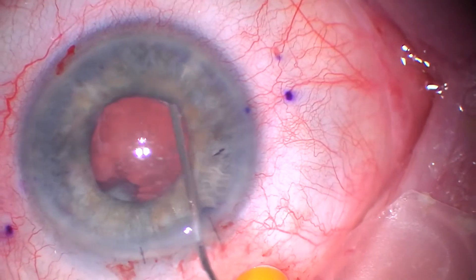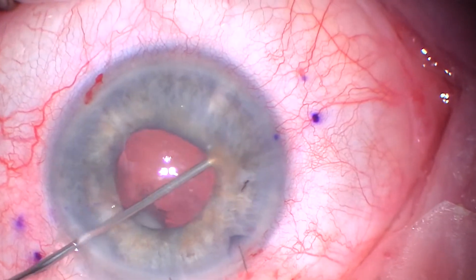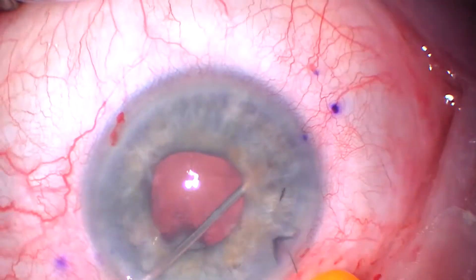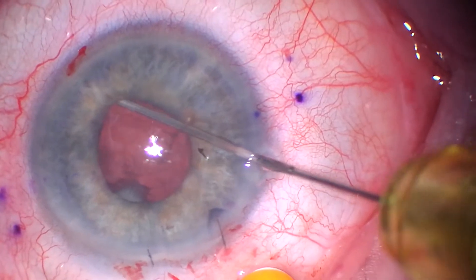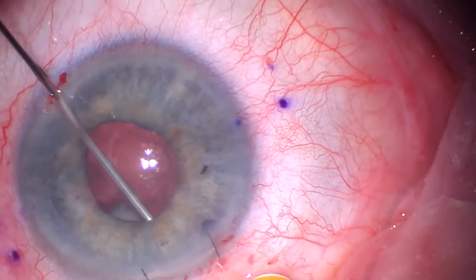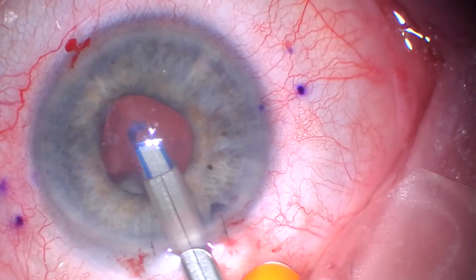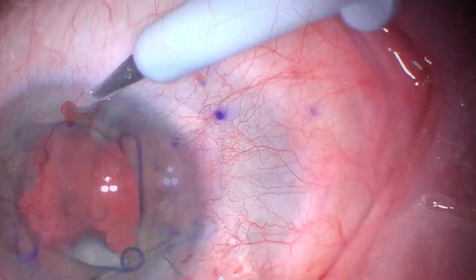Now what I'm doing is just trying to see if there's any adherence from that capsular Soemmerring's material to the iris. And yes, there is. So I tug a little bit — it's not coming — so I give a little push of Viscote and kind of Viscote-dissect it, and we free it up. Going around on the other side, you can see the transillumination where those haptics had just really macerated this iris. She had at least a 0.9 cup, and we discussed at length that I'm not sure how much her vision would improve.